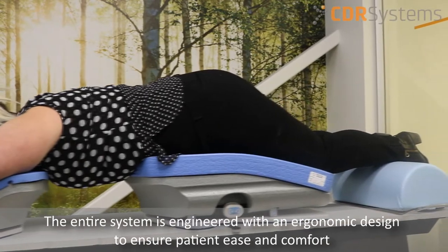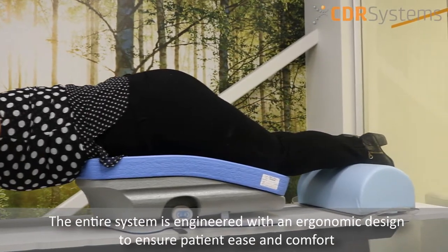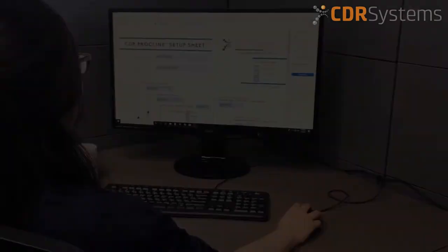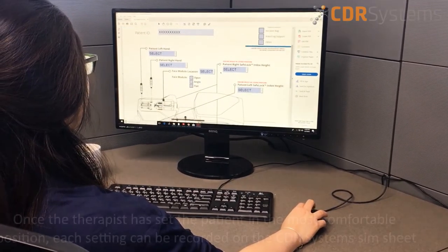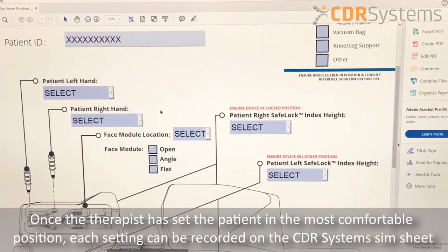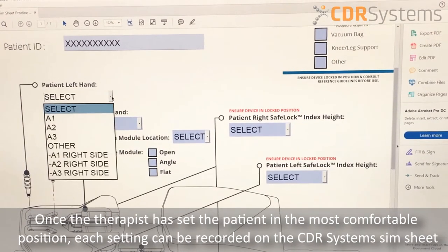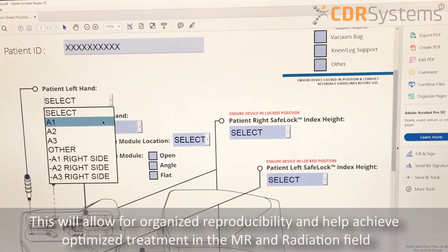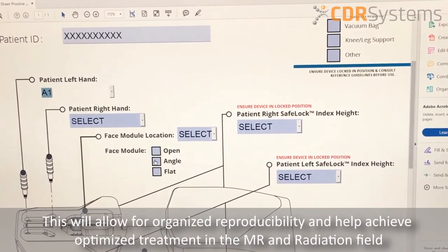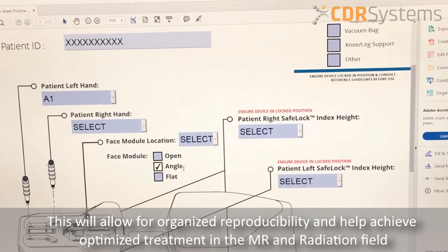The entire system is engineered with an ergonomic design to ensure patient ease and comfort. Once the therapist has set the patient in the most comfortable position, each setting can be recorded on the CDR system SIM sheet. This will allow for organized reproducibility and help achieve optimized treatment in the MR and radiation field.